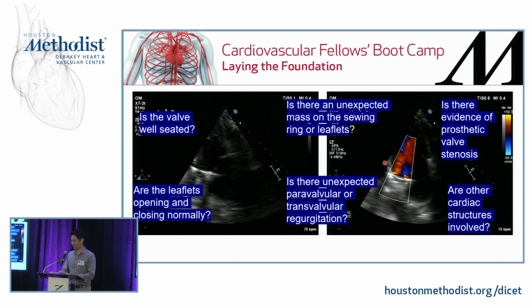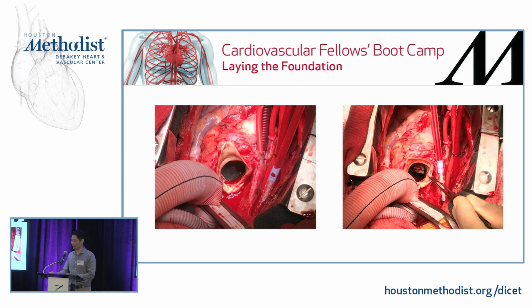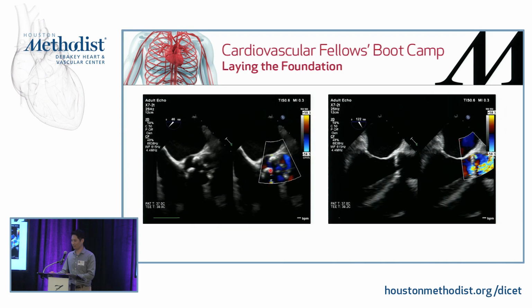So far, looks like everything is okay except for the ascending aortic aneurysm. So we told him that was okay. So we opened it up, and after all of that, he did this part, look down here, it looks okay, it's opening and closing okay, great. So we left the valve alone and we closed him up and he did very well.